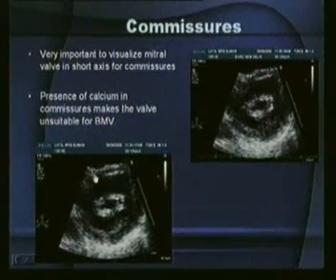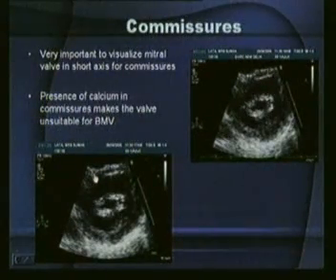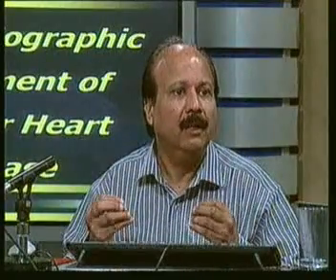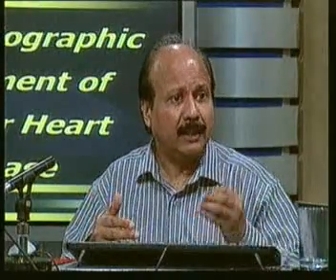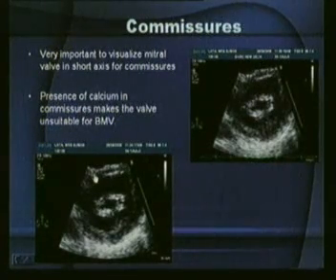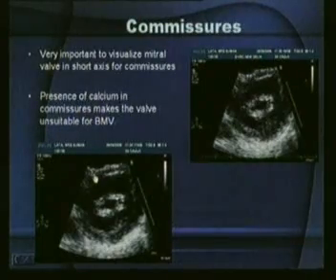We talk of calcium. If both the leaflets are heavily calcified, and you will see that because calcium in the valve leaflets will give rise to acoustic shadowing, and when there is acoustic shadowing, you know that once the balloon goes in and you inflate the balloon, there are likely chances of creating a mitral incompetence or even valve rupture. So as I started this discussion with you, not only will you be able to know the diagnosis by echocardiography, but you will know the timing and the type of intervention. So these two T's are important: timing and the type.